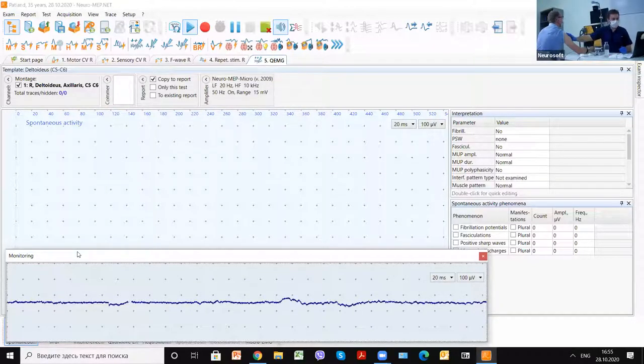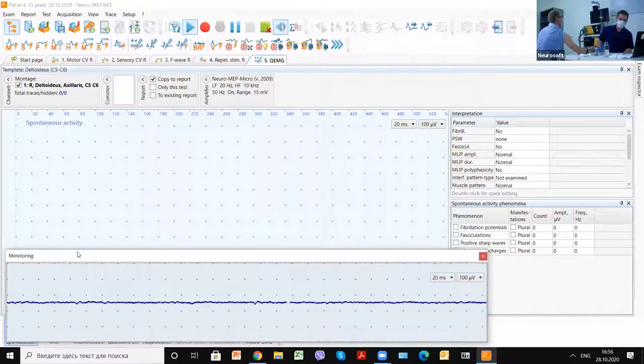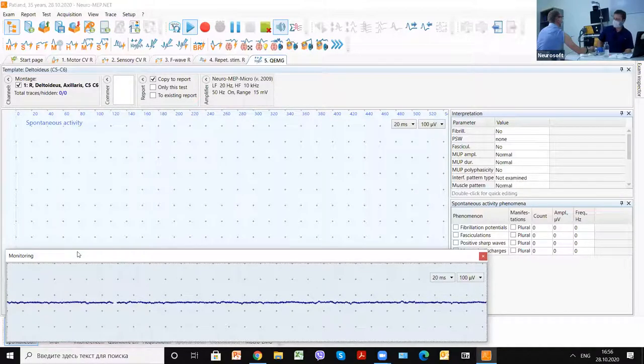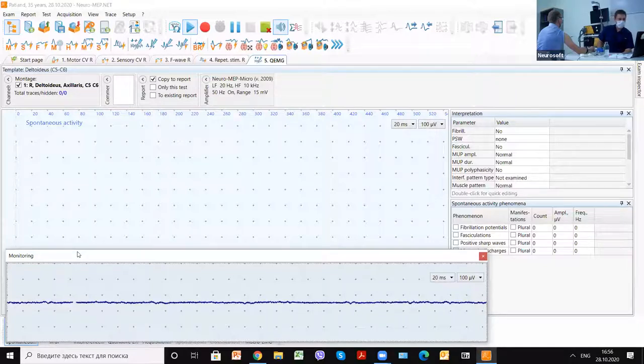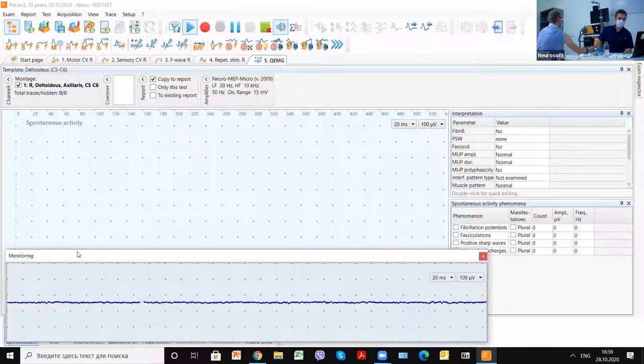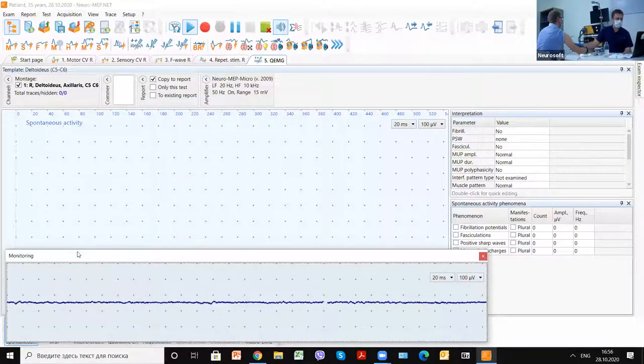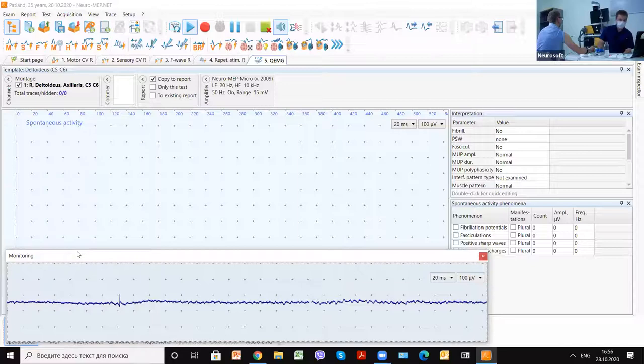Then we estimate the spontaneous activity. In healthy muscle, usually it's absent. We don't see any activity. We can start registration of that.